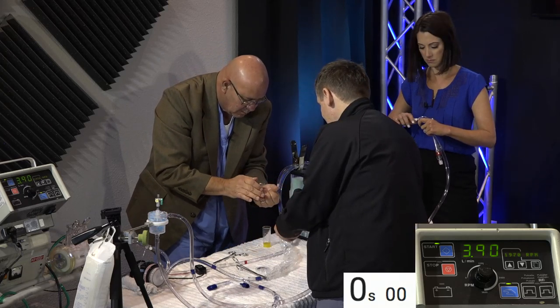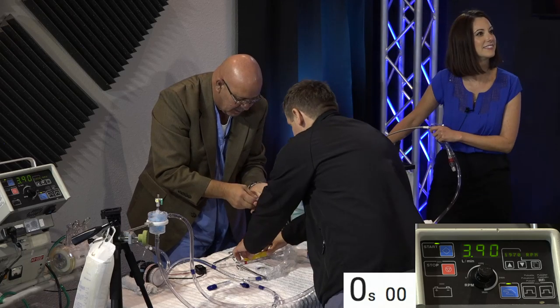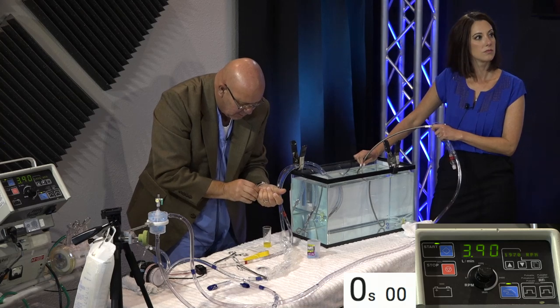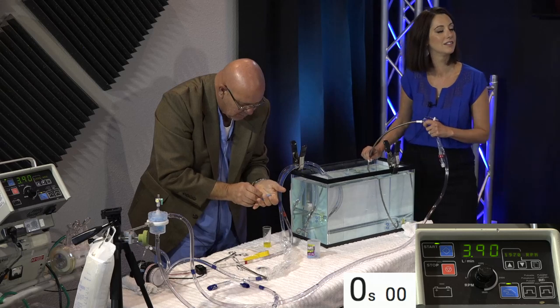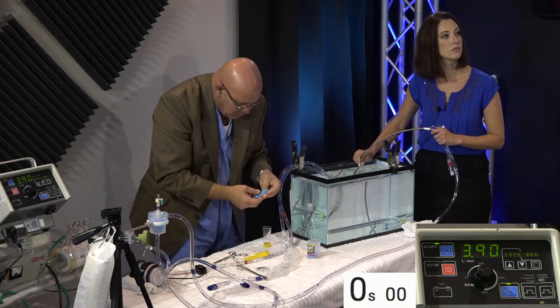And then when we got ready to do three, we found that some of the people in the field were already heat shaping our cannulas, which is outside the scope of the indication, big time. But we engaged with them to be able to find out exactly what angles, why, where.